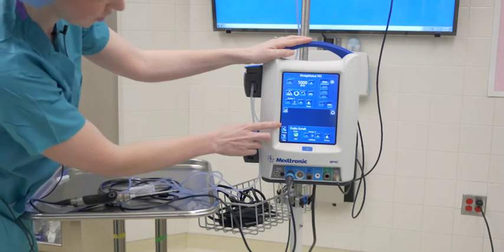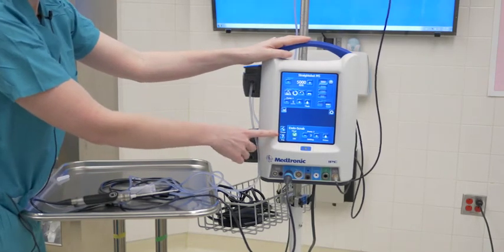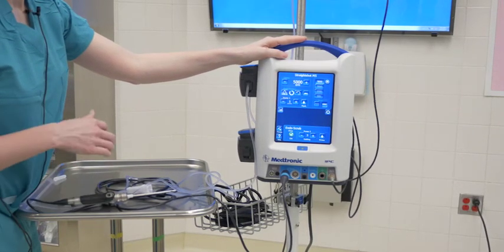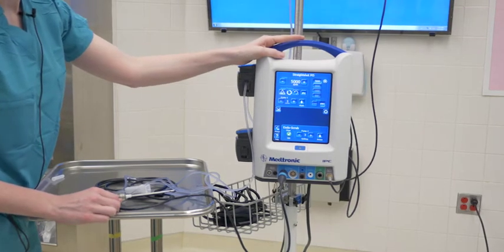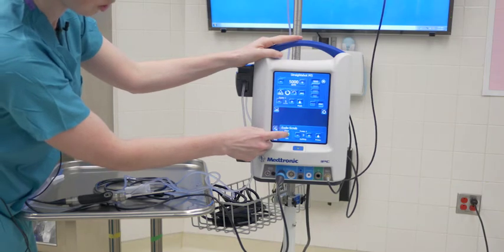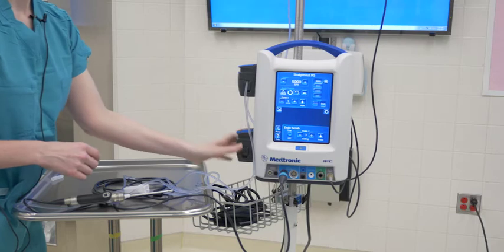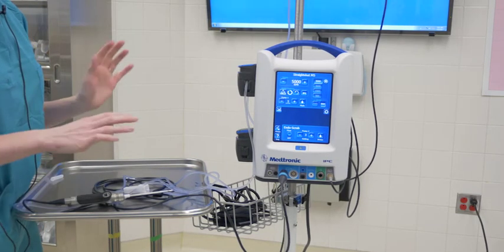You also have a feature down here called endo scrub for the sinus shaver, and it's a sleeve that fits over the end of a telescope to wash the end of the lens. We don't commonly use that here because kids' noses can't accommodate it. So you can just go ahead and turn this off, and the pump won't run for the whole case because it'll expect tubing down here. But you can leave it on too, it won't change anything for you.